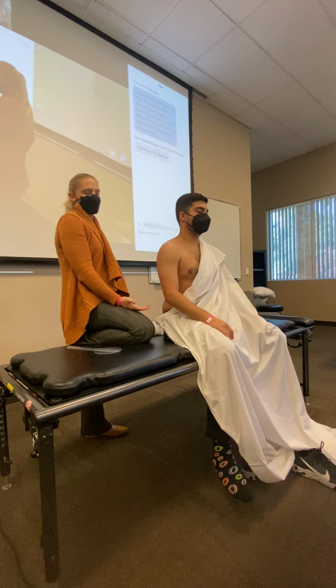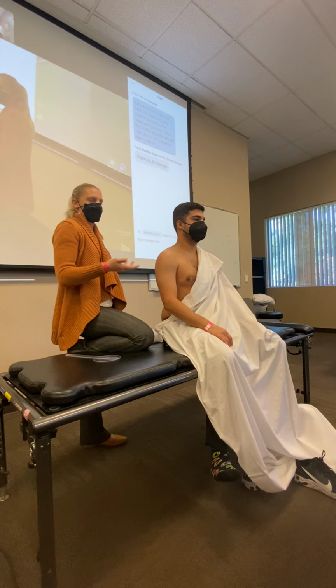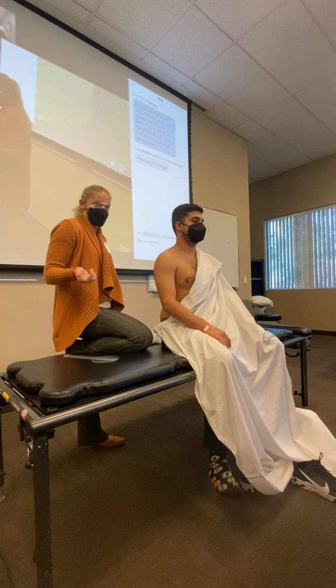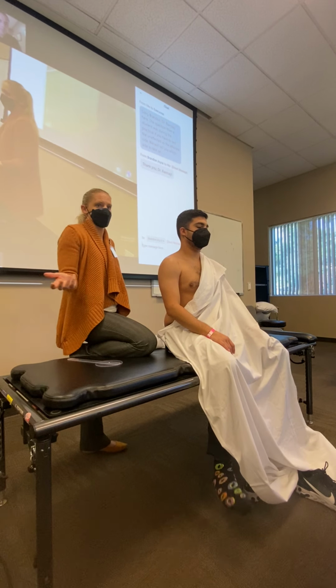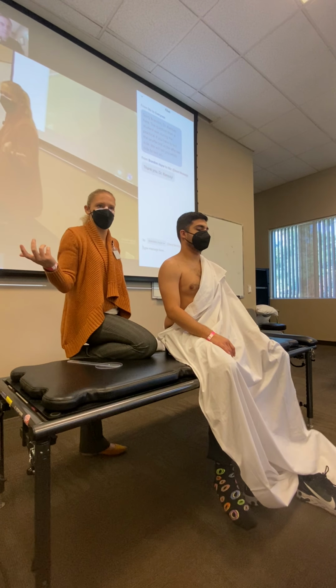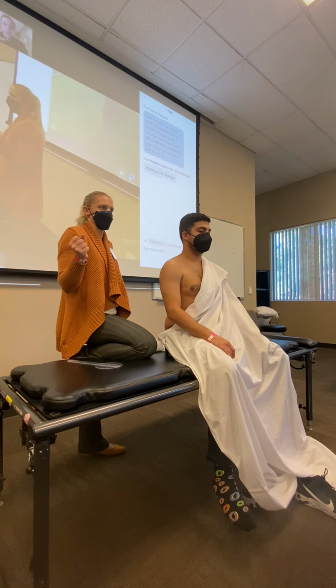Now, if I've done an elbow flexion goni and he has 150 degrees of elbow flexion, and I do an MLT and he also has 150 degrees of elbow flexion, it just means that his triceps aren't limiting him. Does that make sense? Questions on those?